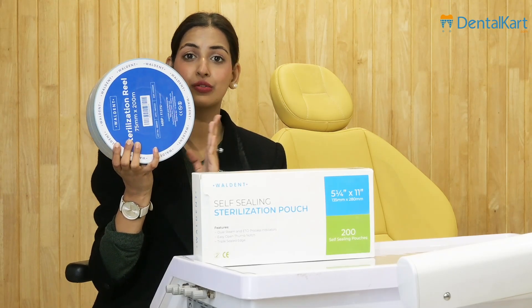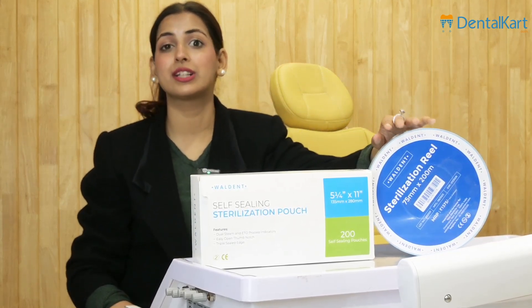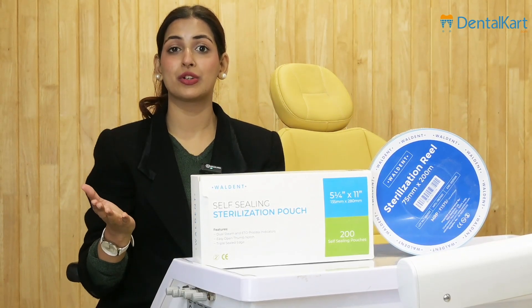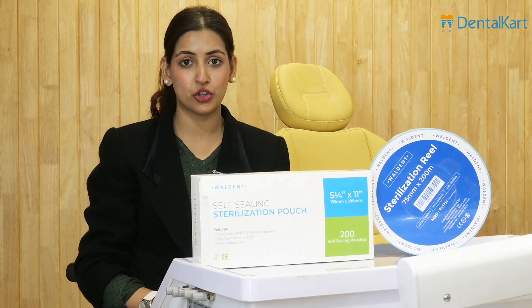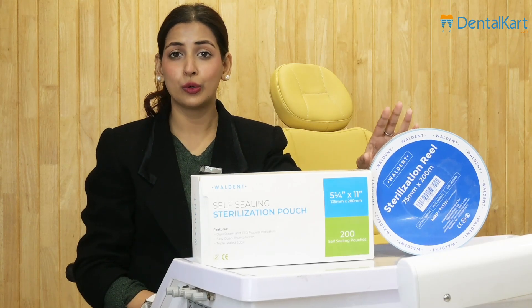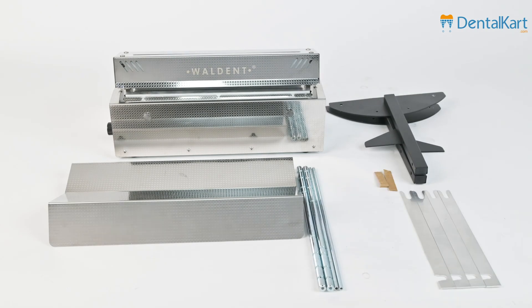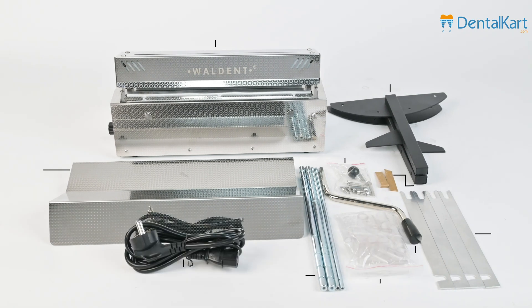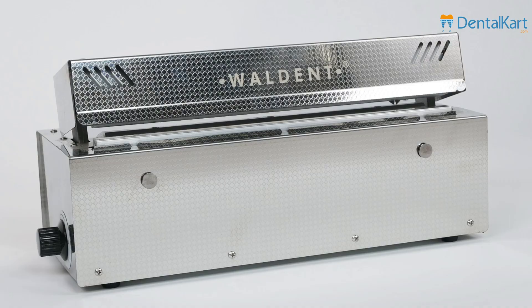Let's see in the video how to assemble the sealing machine, how to put the roll on it, and make the sterilization and segregation process easy.